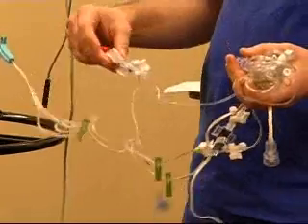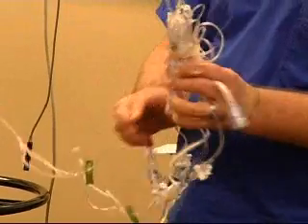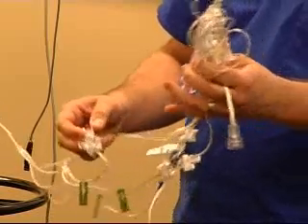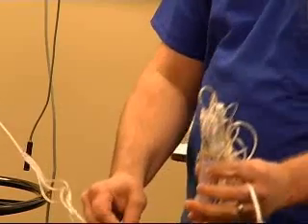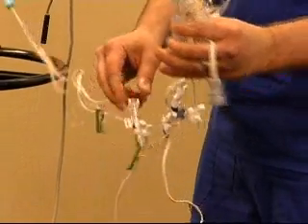One, with the arterial line, making sure that you do pull this back a little bit, so you've got a little bit of a dome to the safe set. And the reason for that is the air trapping that can happen in there. That's actually a manufacturer recommendation. So keeping it pointed up, anyway, you're going to prime your system.